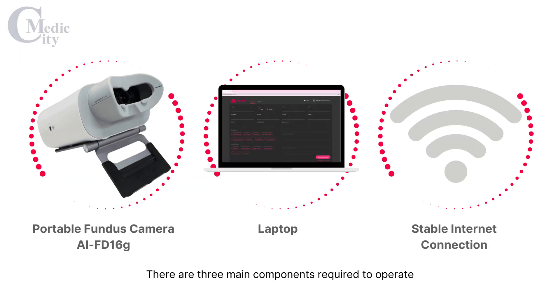There are three main components required to operate the AirDoc AI Fundus Camera: the AirDoc Portable Fundus Camera, a laptop, and a stable Wi-Fi or hotspot connection.